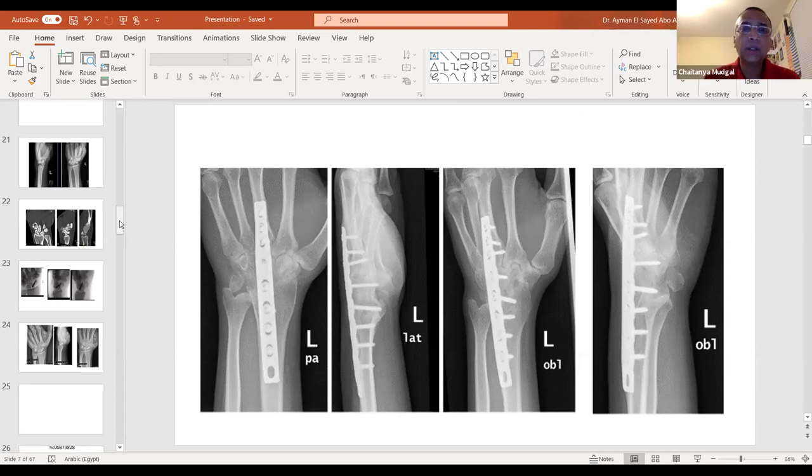When you have small articular fragments, if you have the availability, you should use threaded K-wires. They're fully threaded. And if you have a nice tip-cutting wire cutter, you insert them once and cut them flush with the articular surface, and they behave wonderfully like small headless screws because you don't have to replace them. You can put multiple ones, and that works wonderfully for small articular fragments.